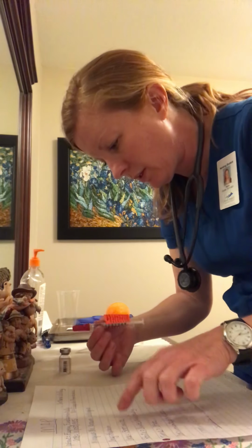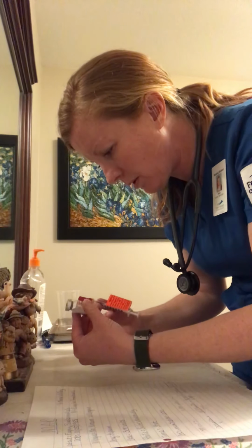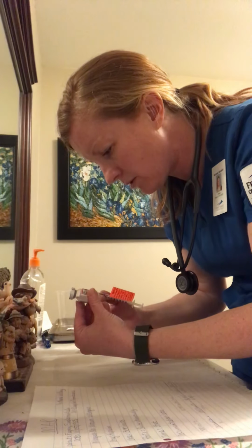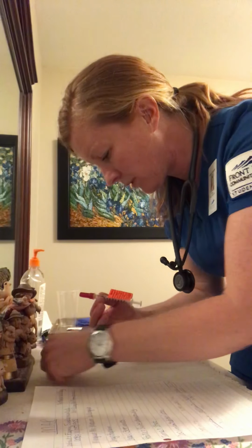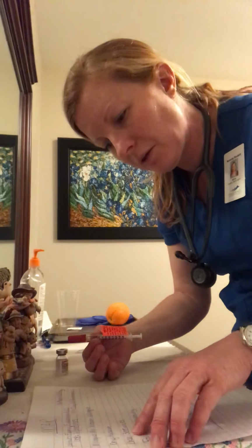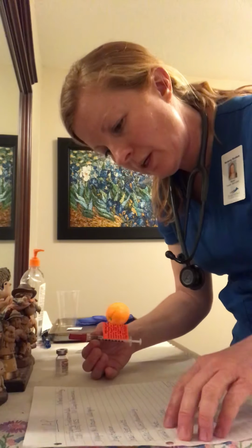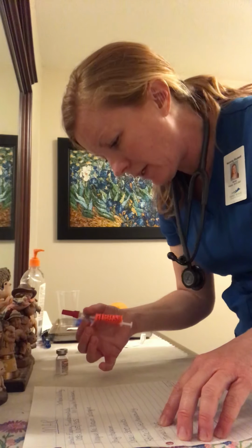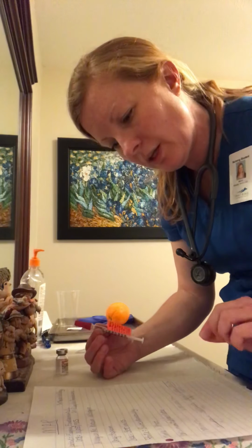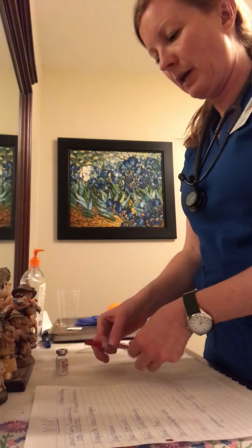Heparin is the medication. 10,000 units per 1 ml is the vial that we're using. Birth date of 11/3/1955. She will be getting 1,300 units, so I have 1,300 units subcutaneously. Time is stat, so we have 1940 on our medication label, and we will document later. So now I will be taking this into the room, which is over here.